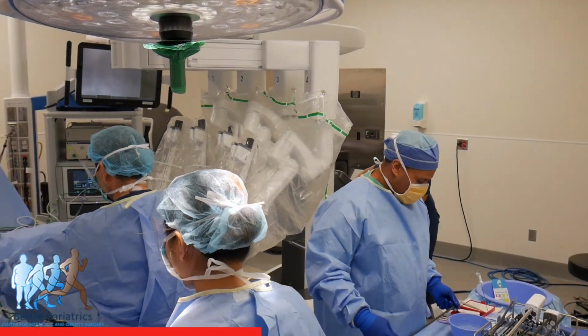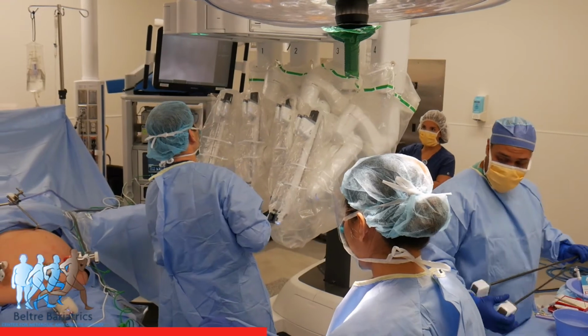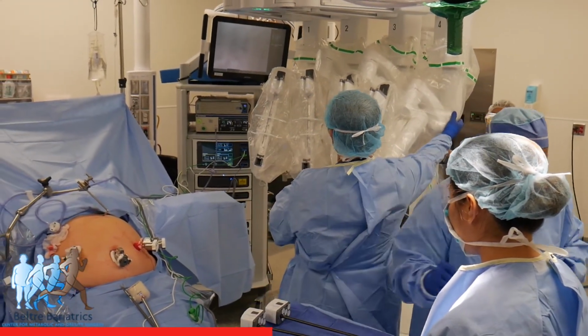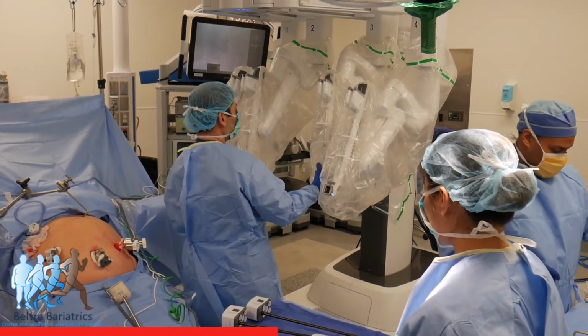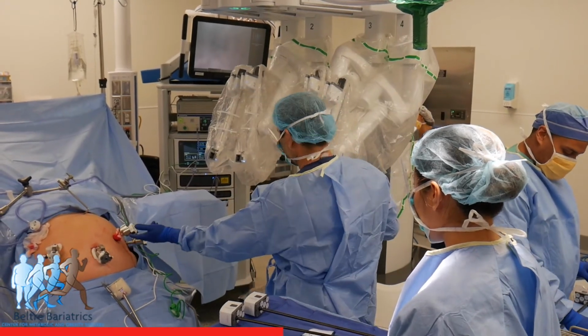Now you can see how they bring in the robot. Pueden ver como traen el robot. The robot is in a boom that is going to be turning around those things that were moving, actually the different arms of the robot. Eso que estamos moviendo allí son los diferentes los brazos del robot.